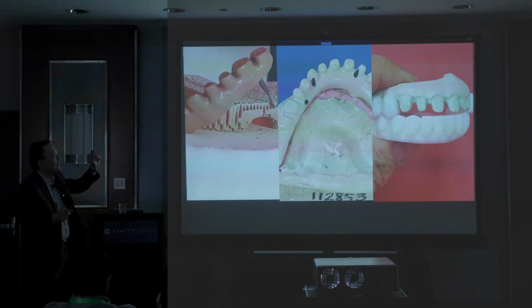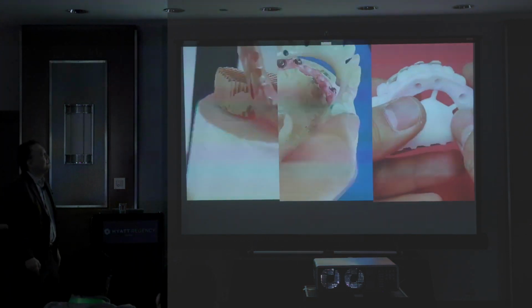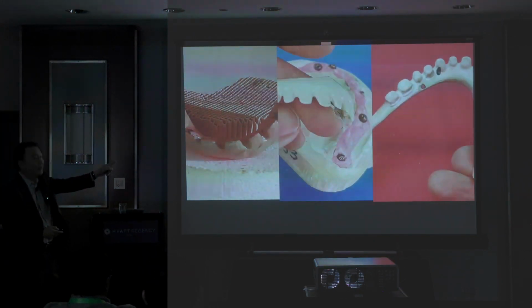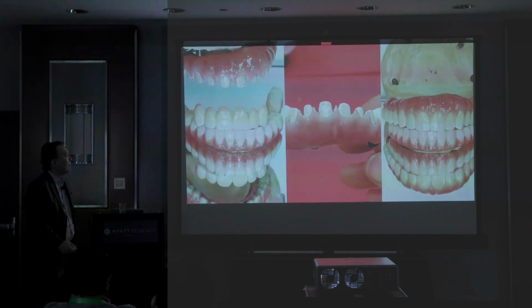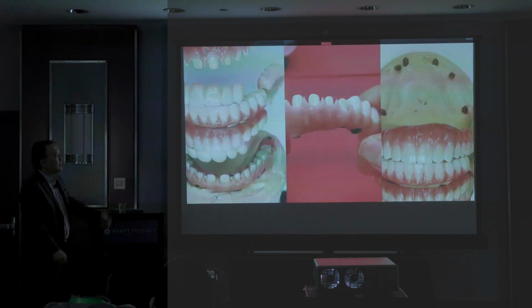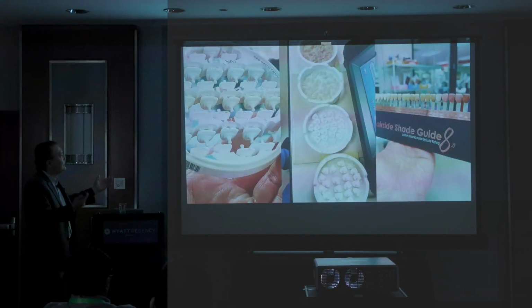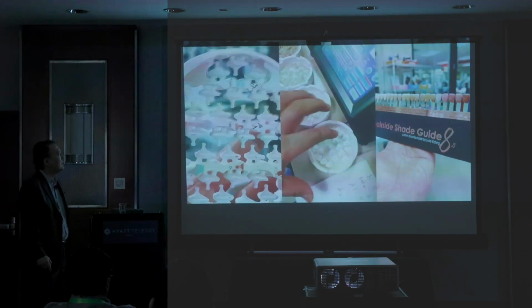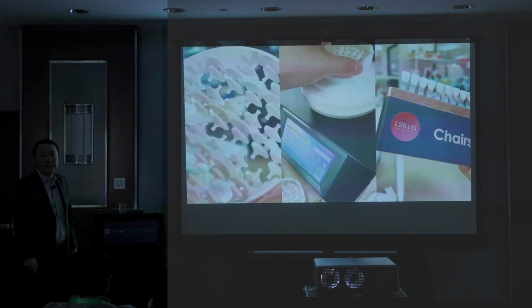So baking, lower zirconia. Okay? See, the thin is exceptional. You cannot make zirconia like that. So here is the final. Right? And the cementing, the matching, the final work. Anyway, I'm going to finish my shade guide like this. It's almost there. So I changed the world. That's my dream. That's my last legacy.